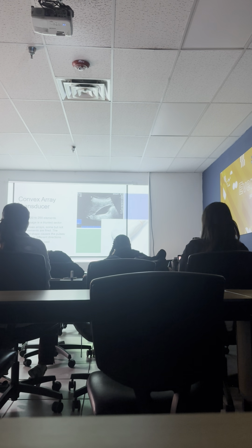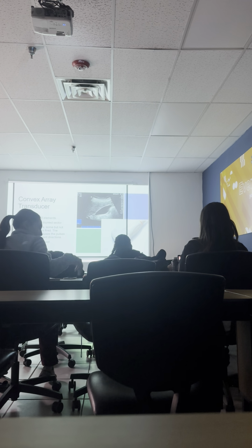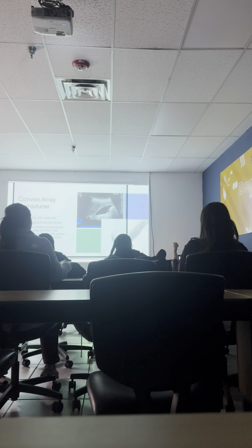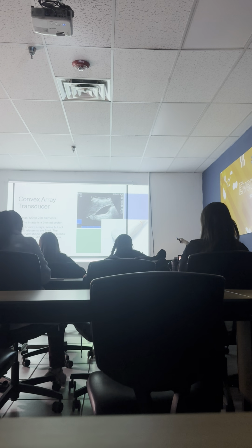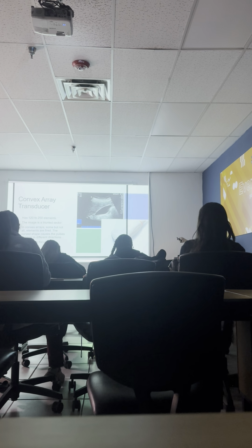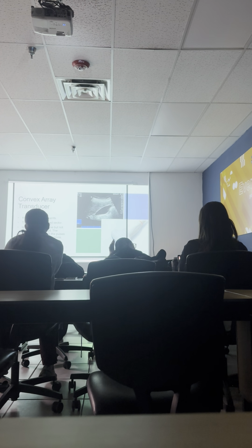Hitting someone in the head with a bat is different than hitting them in the head with a knife. So we can see that this point is not sharp, it's blunted. So this is a blunted sector, because a sector is like a pie.